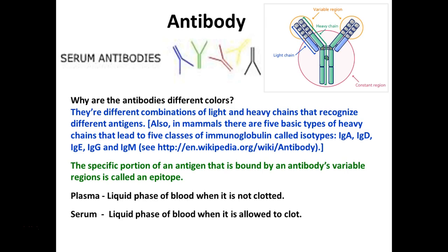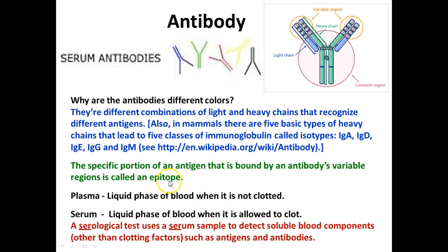So when you have a droplet of blood and it clots, all of the clotting properties have drawn to the... Yeah, most of them are in the clot, yeah, that are in the liquid phase.